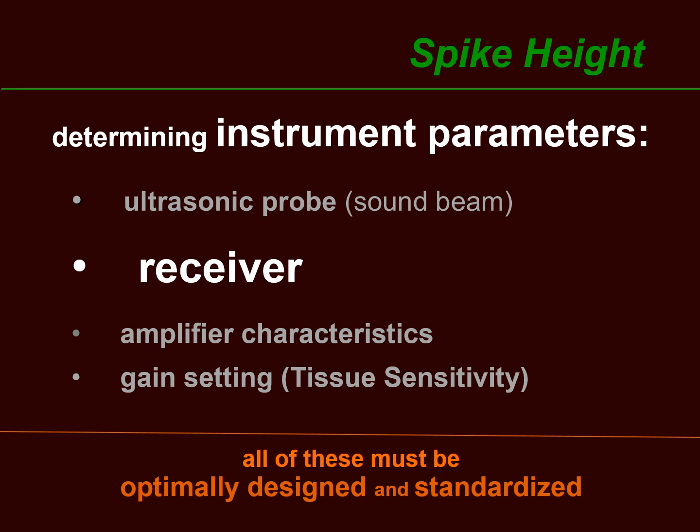And the main function of the receiver is amplification, so that the signals can be strong enough to influence the display on the screen.